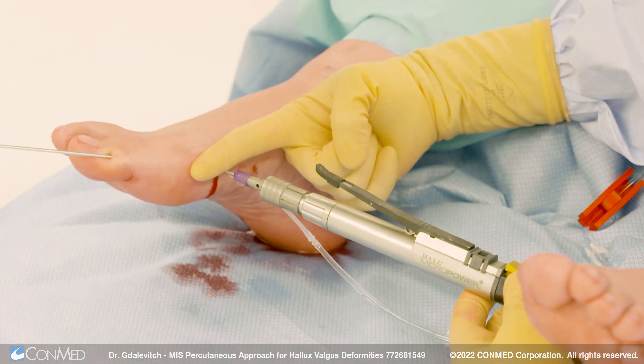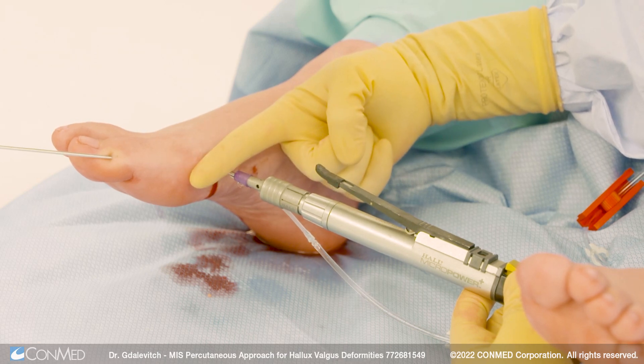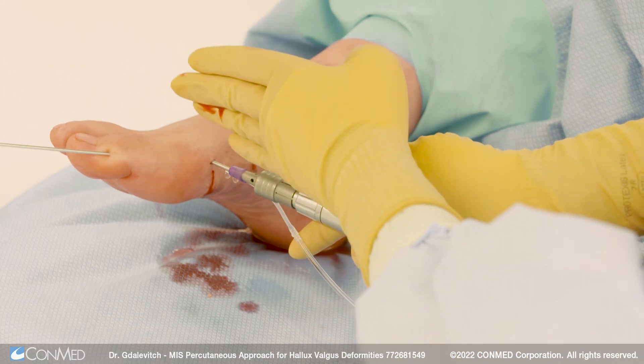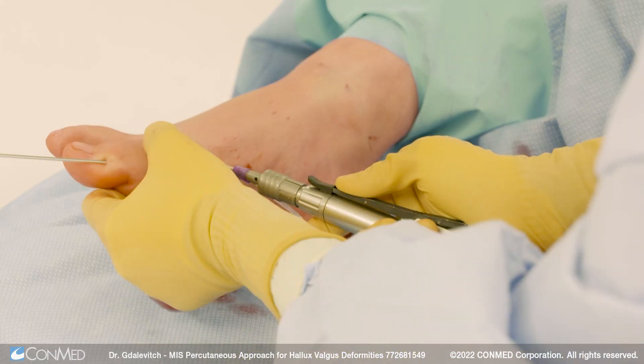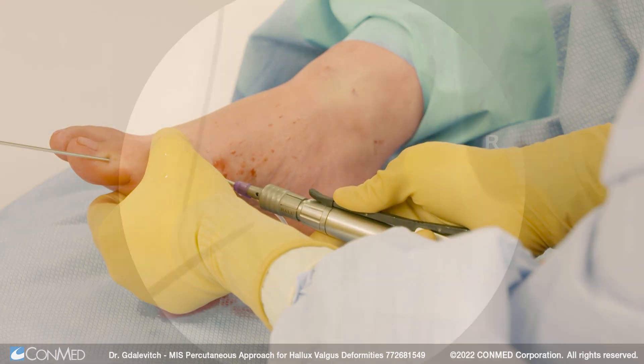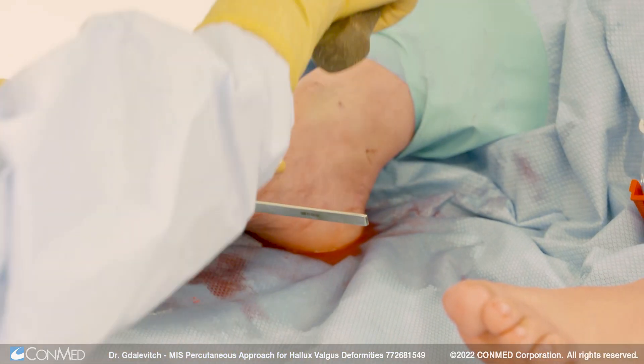You want to make sure that you're perpendicular to the first metatarsal ray, which has a natural plantar inclination. So when cutting in the sagittal plane, keep in mind 90 degrees in both the coronal and sagittal planes. You can feel when you go through the bone on both the dorsal and plantar side. In a young patient, we want to pierce the lateral cortex again a few times and then use the osteotome to complete the osteotomy.